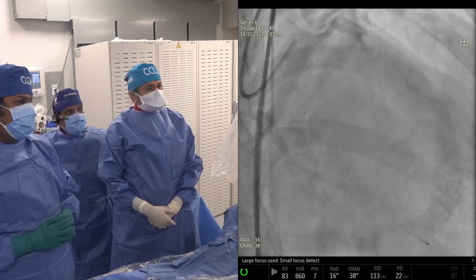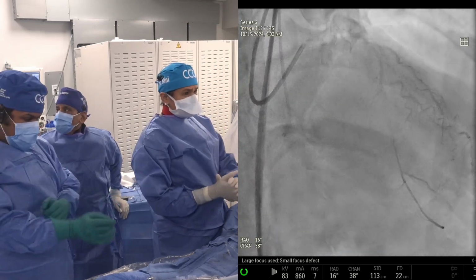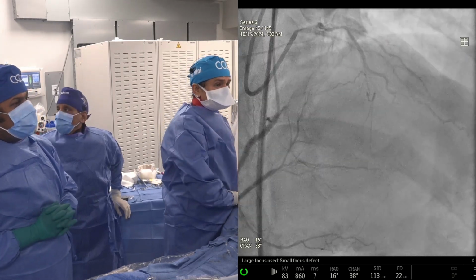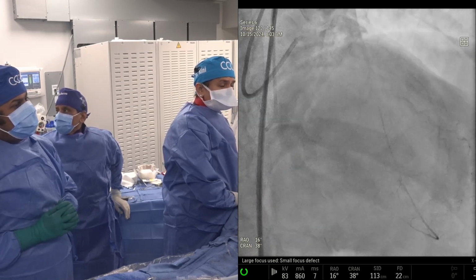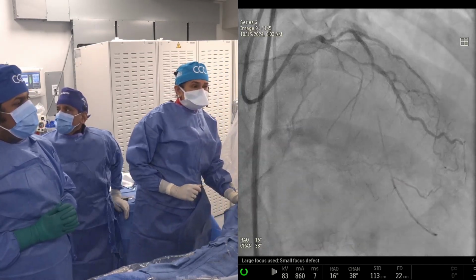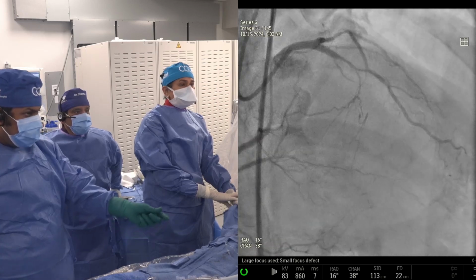I don't see the calcium. Non-calcified, but let us tell what the JCTO score is here. One, if you see that length, definitely maybe 20, right? About more than 20, yeah. So that one fits there. And the other one, we can say it's tapered rather than blunt. Yeah, blunt. And no 45-degree angle there. That's one. No calcium, I would say. So we probably will get a JCTO score of, now the side branch.